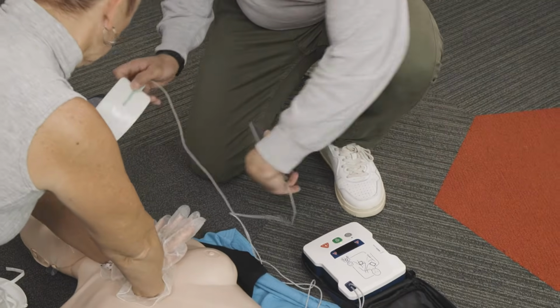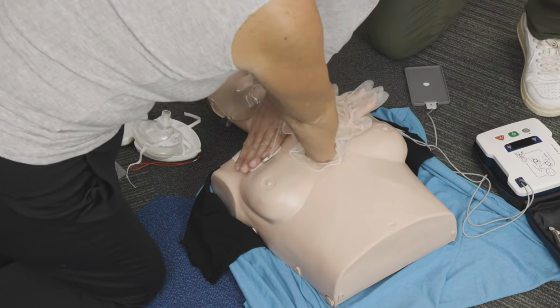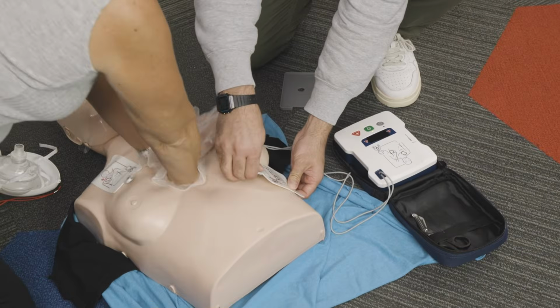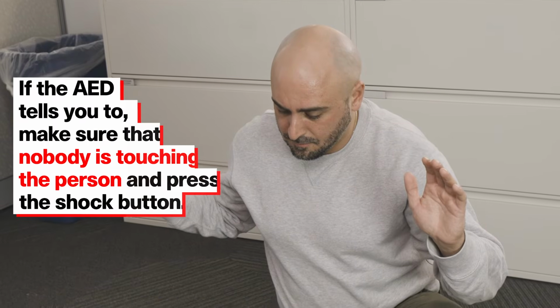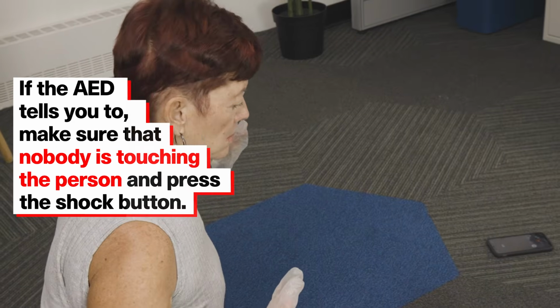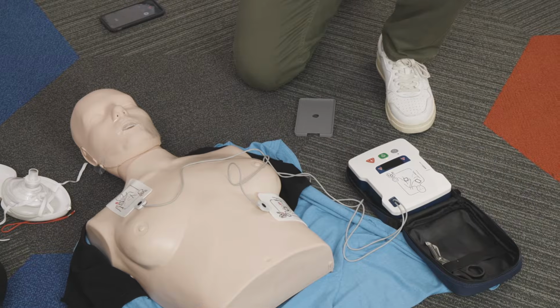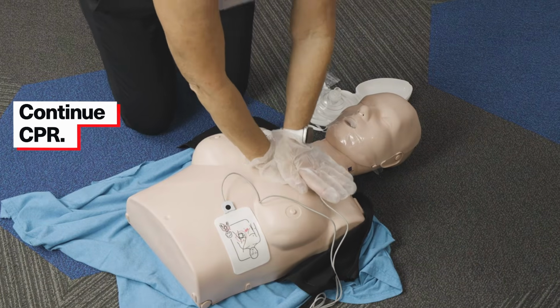Dry the skin if it's wet, and place the pads at least 2.5 centimeters away from a pacemaker. If the AED tells you to, make sure that nobody is touching the person and press the shock button. Continue CPR starting with compressions.